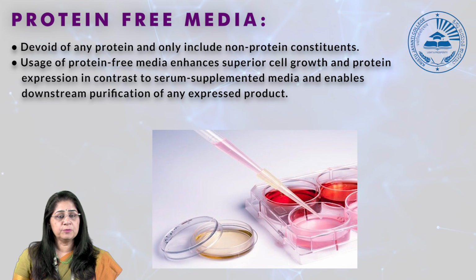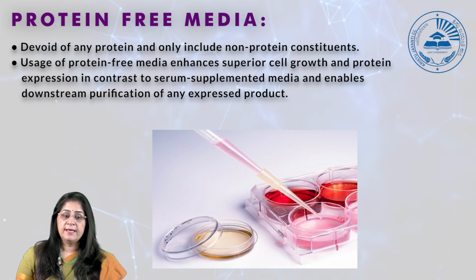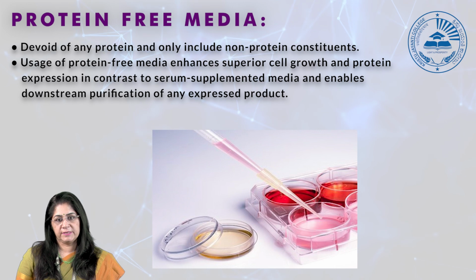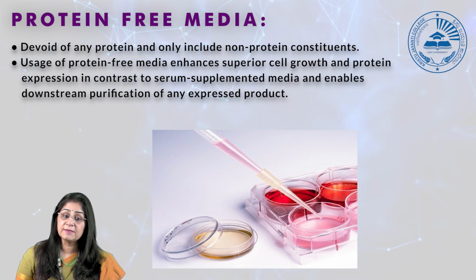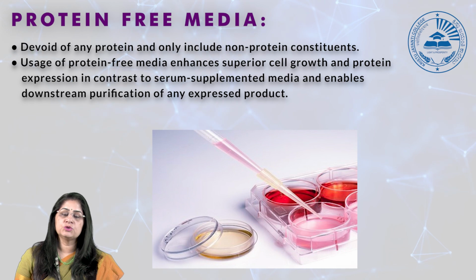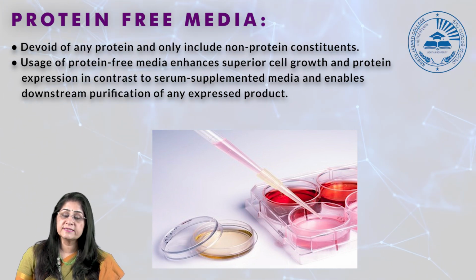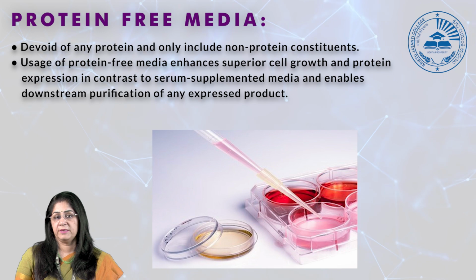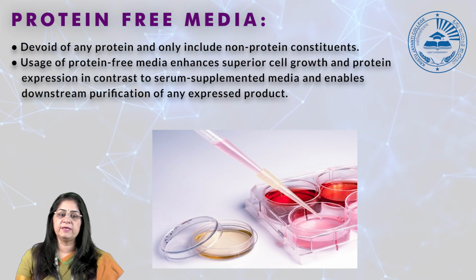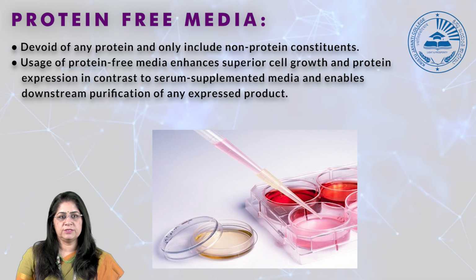So usage of protein-free media enhances superior cell growth and protein expression in contrast to serum supplemented media, and enables downstream purification of any expressed product. So this is also another important thing. So it is easier to purify. Downstream processing is much easier if you are going for protein free media. So that is the main advantage of protein free media. You don't have to spend much on the downstream processing part.